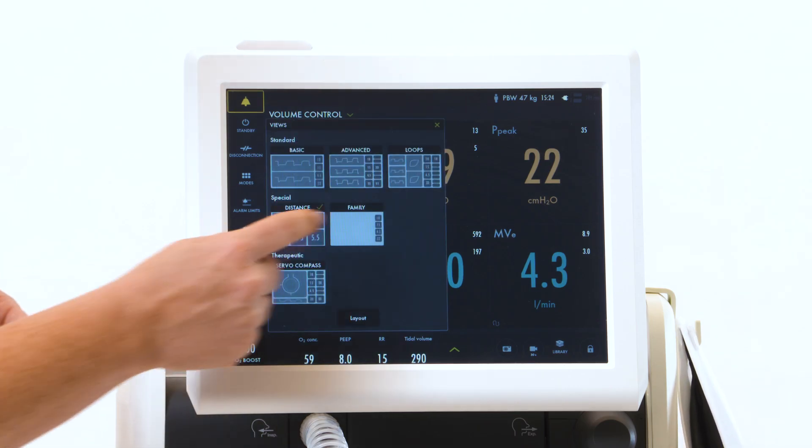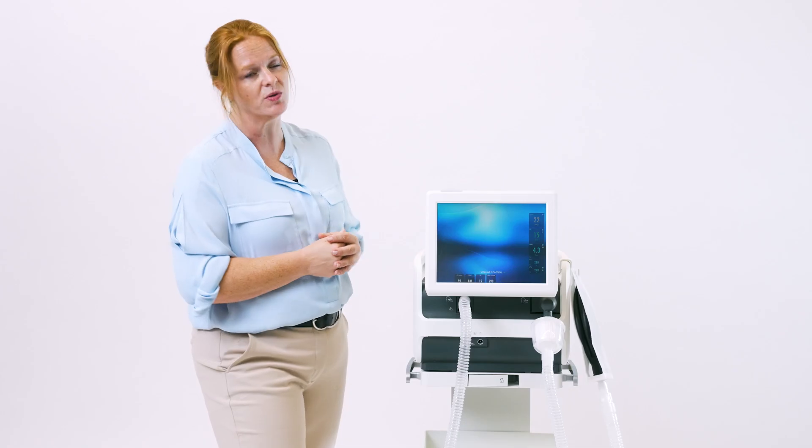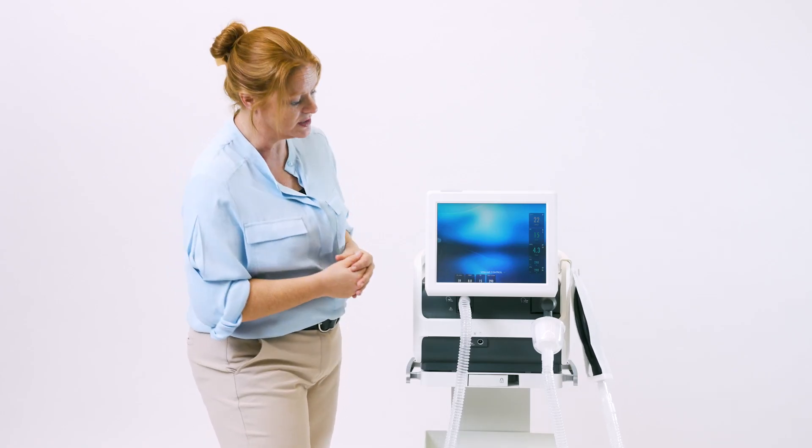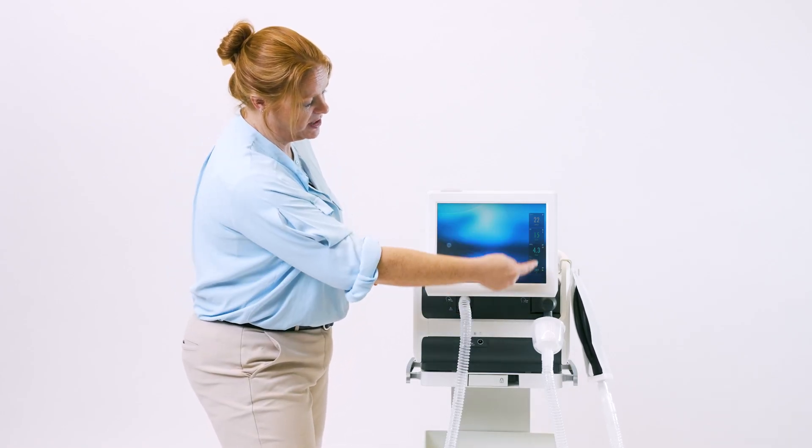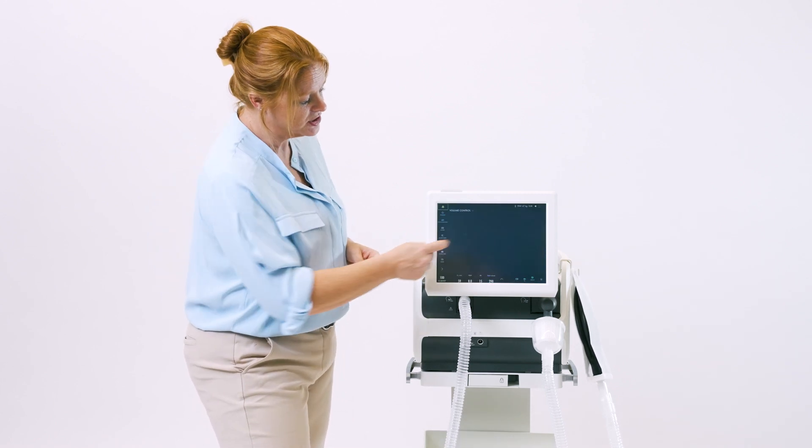When you look at your family screen, it's a more simplified view. You still have your settings and measured values. The bubbles indicate that ventilation is occurring. In order to get out of the screen, just touch.